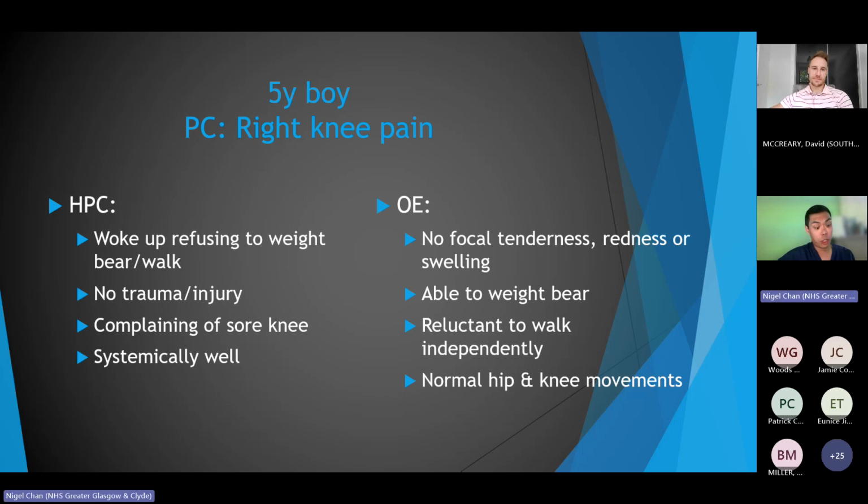Similar story. This one was a 5-year-old boy who was triaged as knee pain without any injury. How do you know that's not a septic arthritis? So the question in the room was, how do you know it's not a septic arthritis rather than just a transient synovitis?